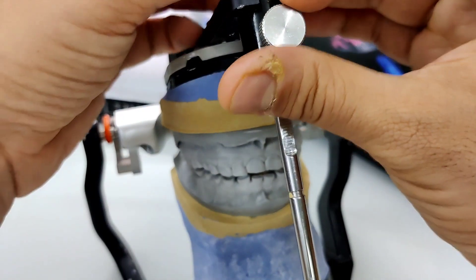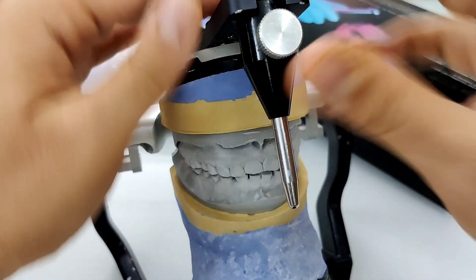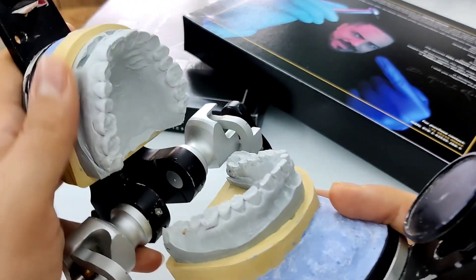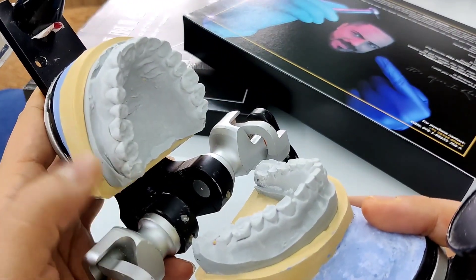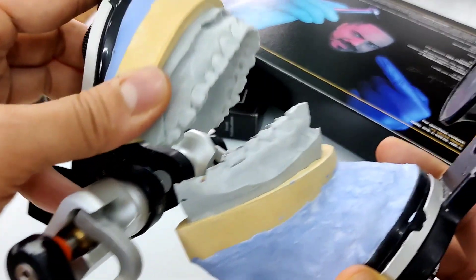Now as I open the incisal pin and lift this up, the teeth will go and contact each other at RCP — that's the first point of contact in centric relation.